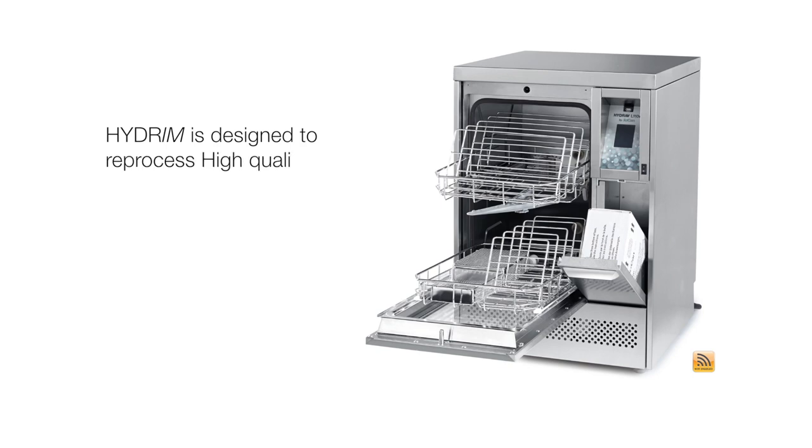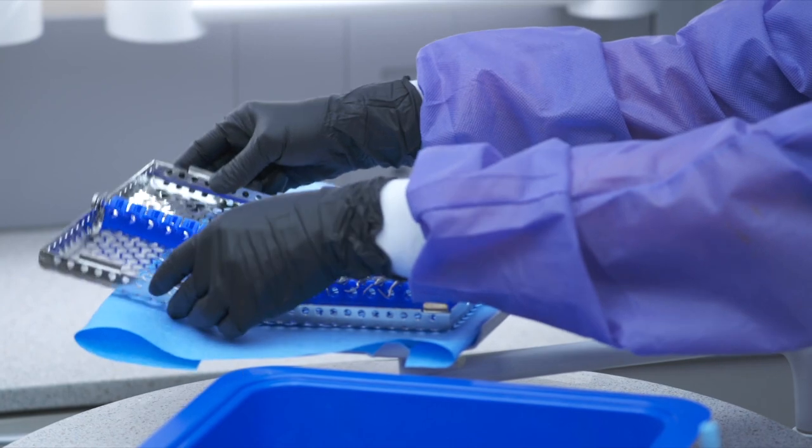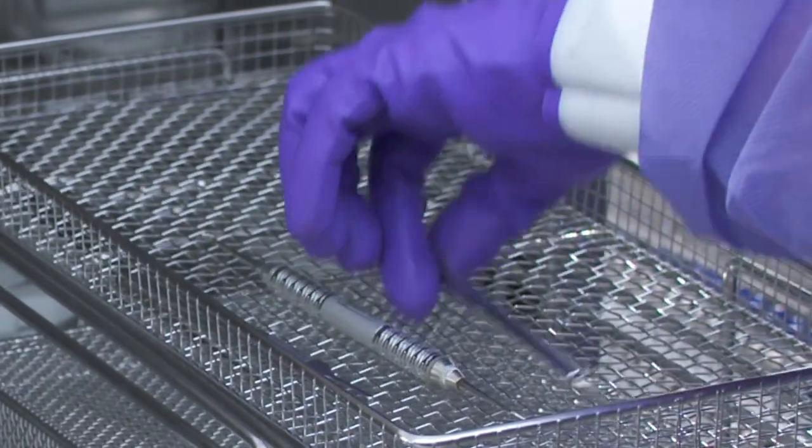The Hydrum is designed to reprocess high-quality stainless steel and plastic instruments. Not all instruments and cassettes are compatible with the Hydrum. Do not reprocess dissimilar metals such as ultrasonic inserts, carbide burrs, and aluminum, anodized, or chrome-plated instruments. Depending on the type of instruments, place them either in instrument cassettes or in one of the baskets that came with your Hydrum.